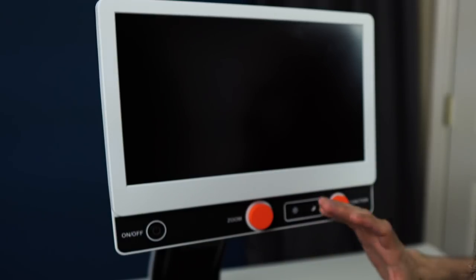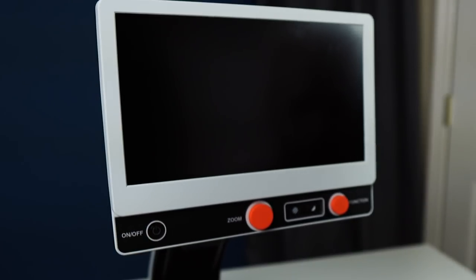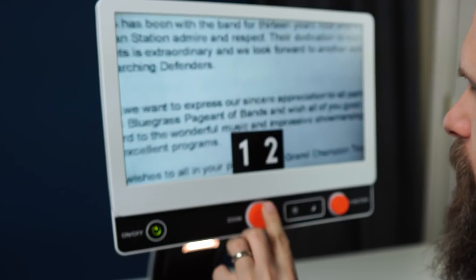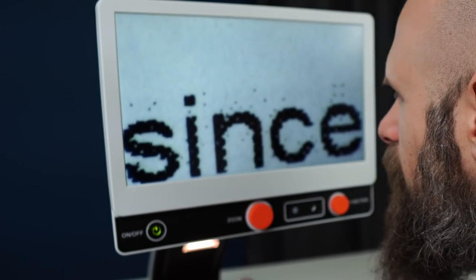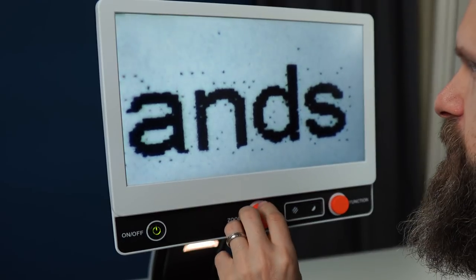Let's take a look at the controls and functions of the Zip. All the way to the left you have the power — we'll go ahead and turn it on. We have a large dial right here in the middle; this is our magnification. And that is as big as we can make it — about 22 times magnification.